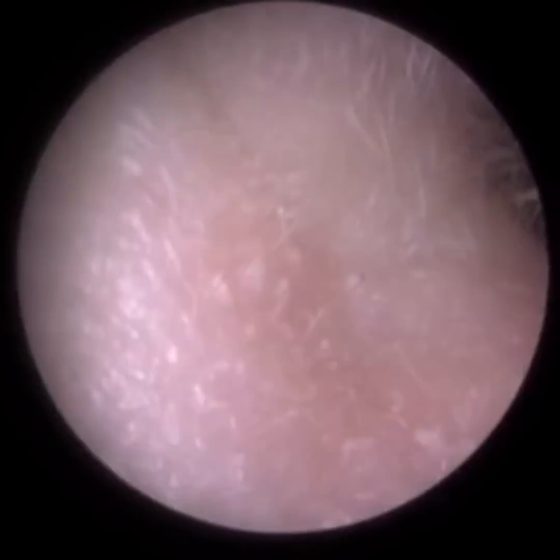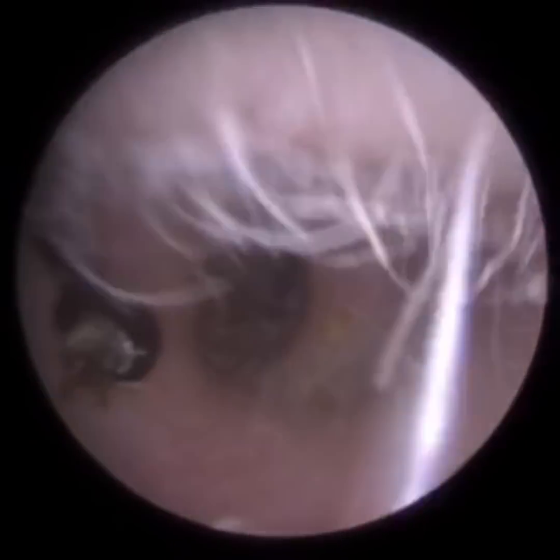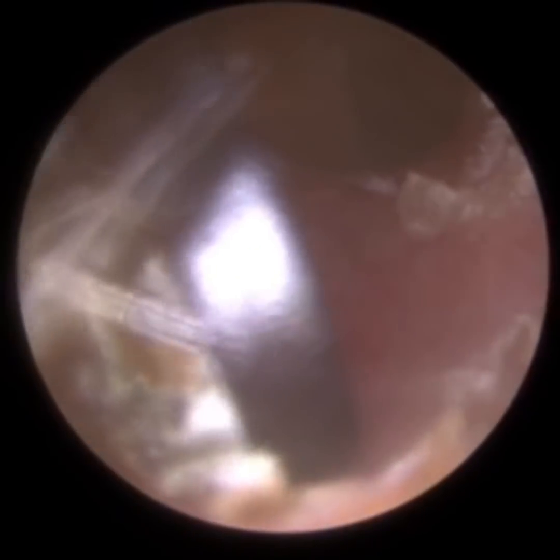The patient says no. So it could alternatively be a bit of a fungal infection. You can get fungal stems of fibres that look like cotton wool fibres, and sometimes you can get spores developing. We're going to keep an eye on that, and if it is a fungal infection, the patient can use some clotrimazole drops to assist.